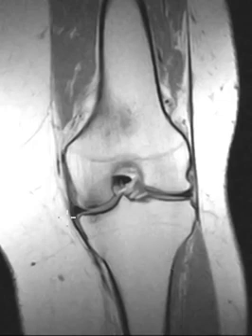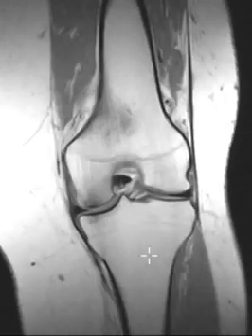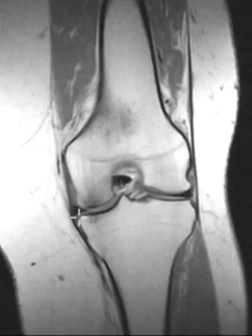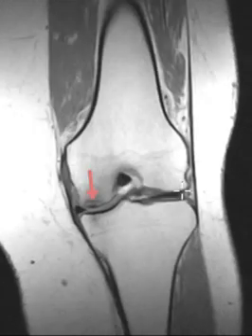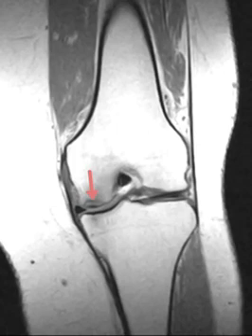This is an MRI of the knee. We see the medial side — this is the femur, the big thigh bone coming down, and this is the tibia down below, the leg bone. We see a round area of the femur called the femoral condyle. On the lateral side there's a round area, and on the medial side we see a little black wedge called the meniscus that fits right in between, and another little black wedge over here. The main finding is on the medial side: there is a black line following the articular surface, parallel to the articular surface.